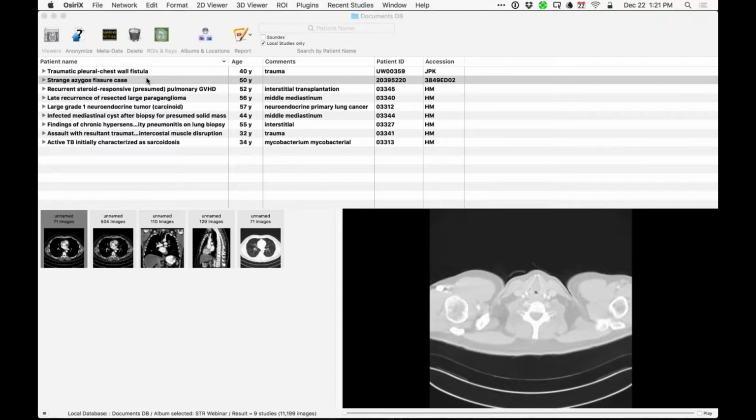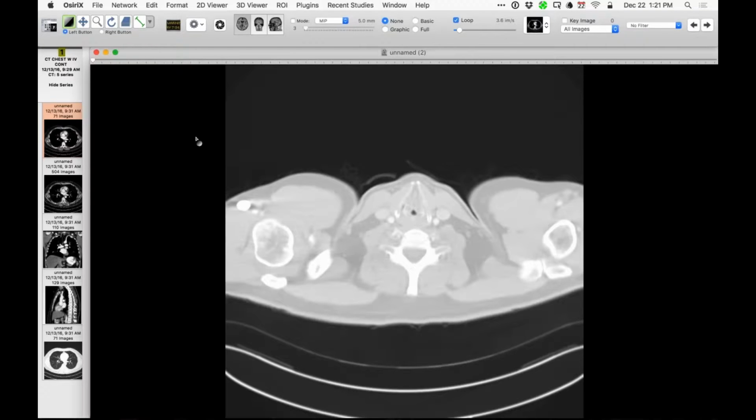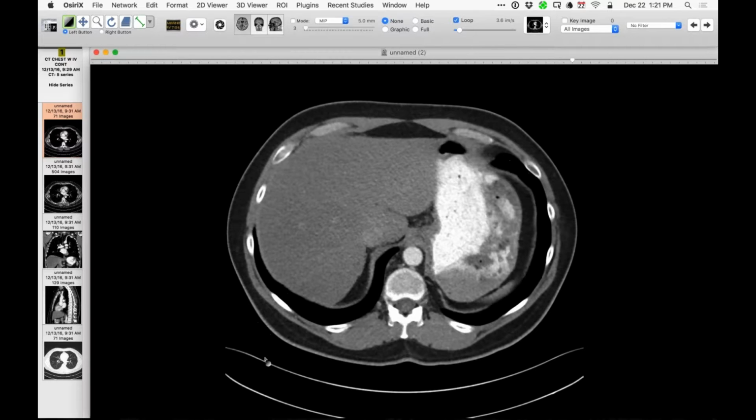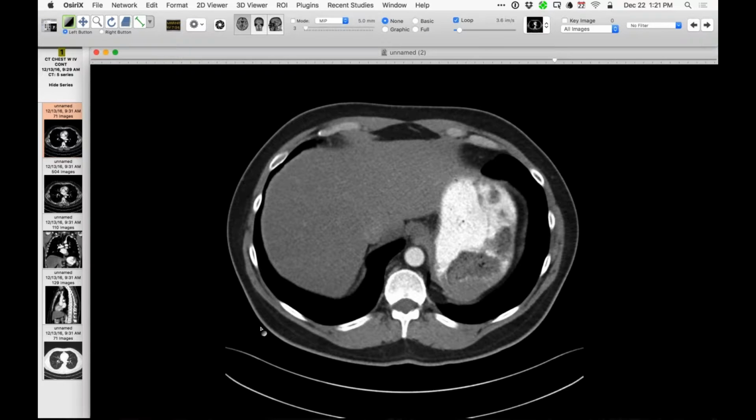Let me start off with a nice anatomy one that you showed. So here we go. Let me start this in this fashion. Go from below down, and we'll look at the azygos, hemiazygos veins and go up.